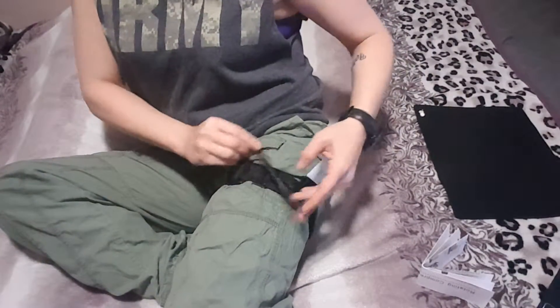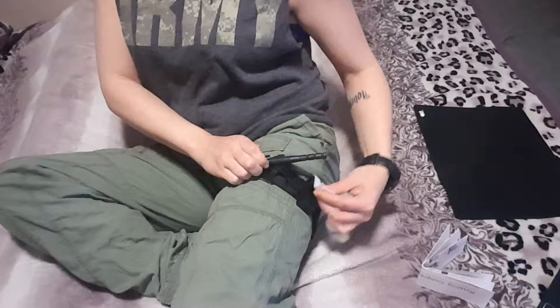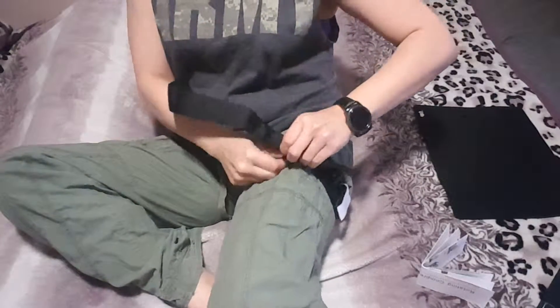Very simple. Pull that out, pull that out, unwind it. Now let's put this back in place — Velcro, pull up, just like a regular belt, and back off again.